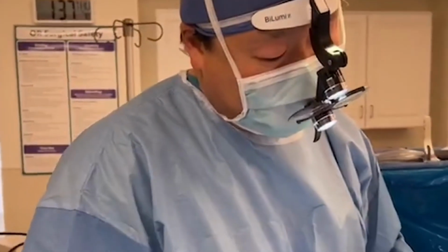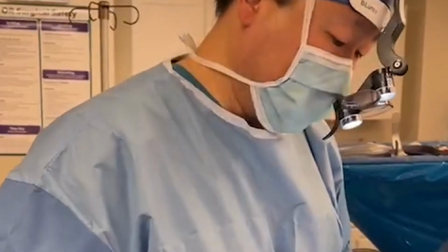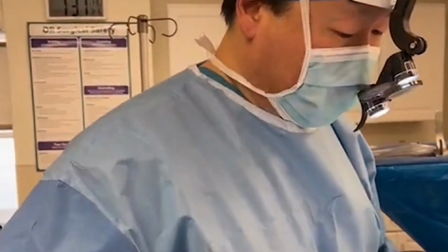So if I go underneath the fascia, technically above the muscle, but remember, above the muscle fibers, but under the fascia, and we're still not underneath the breast tissue, because remember, you have skin, breast tissue, fascia, and muscle, and we're going under the fascia. I can actually create a circular pocket for the implant, and that is called the subfascial approach.